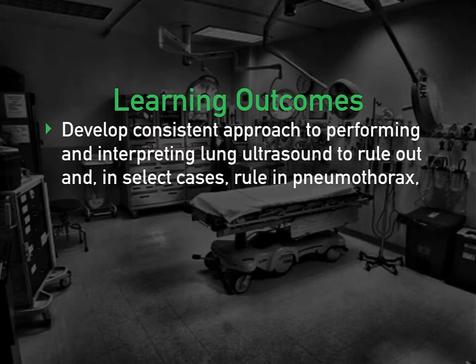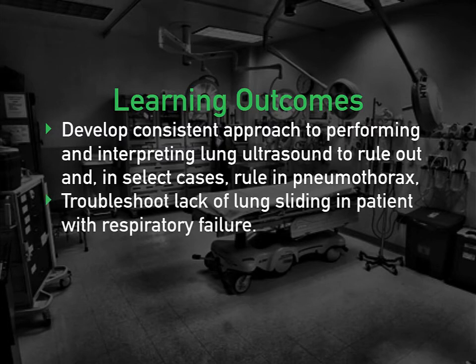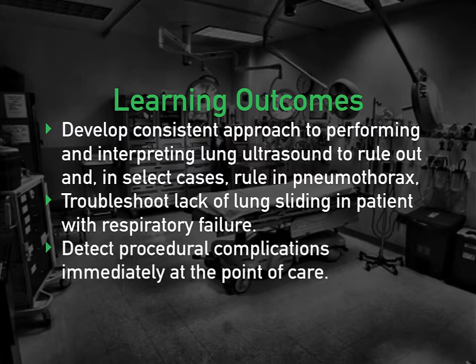So we're going to talk about developing a consistent approach to performing and interpreting lung ultrasound to really help us detect and rule out pneumothorax. We're going to troubleshoot lack of lung sliding in a patient with respiratory failure and detect procedural complications immediately at the point of care.